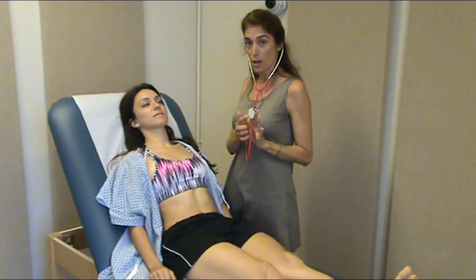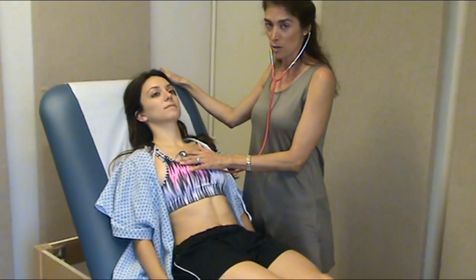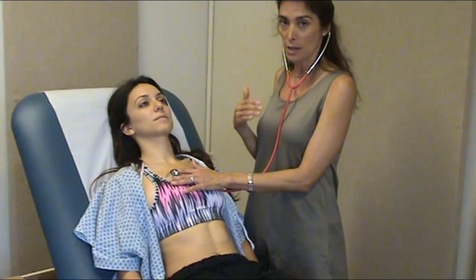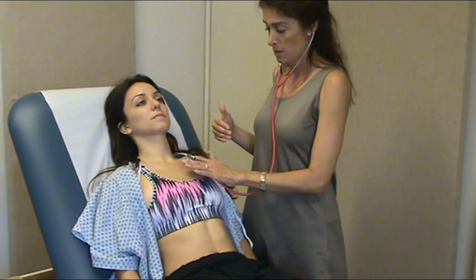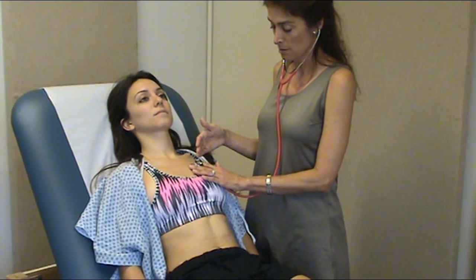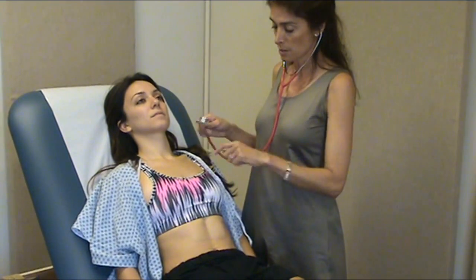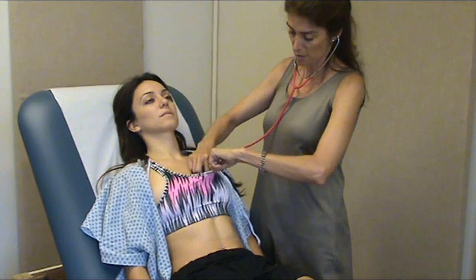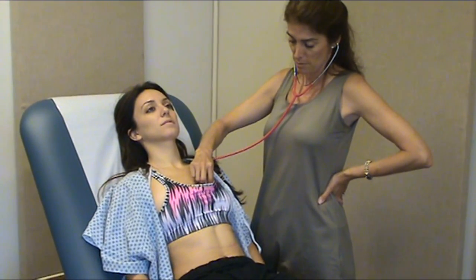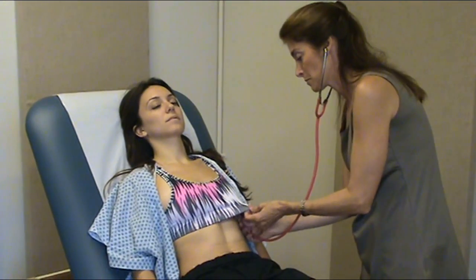You're going to make sure that you auscultate with the diaphragm of the stethoscope over each valve. It's very important that you are listening for a period of time where you're actually trying to distinguish S1 and S2. So listen to the aortic, then I'll come over here and listen to the pulmonic. Again, keeping the stethoscope on the skin with preserving all modesty, you can still listen to the tricuspid. And then listen to the mitral.